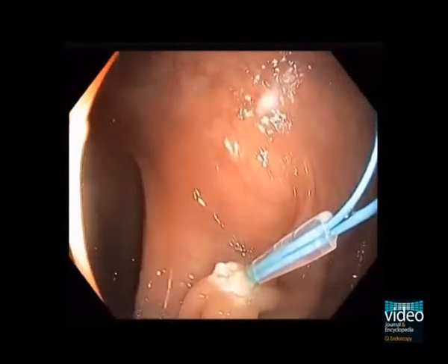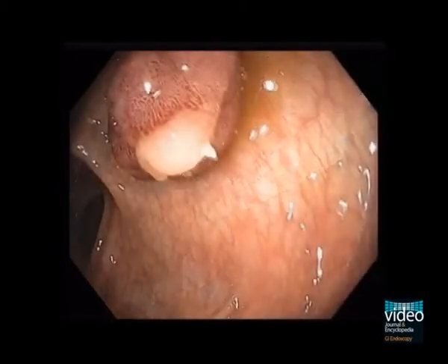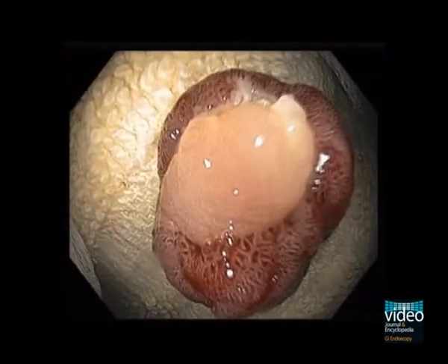After polypectomy, the Enderloop is still tightly secured. This patient did well and did not have any post-polypectomy bleeding. The histopathology of the polyp showed tubular villous adenoma and a clear stalk margin.